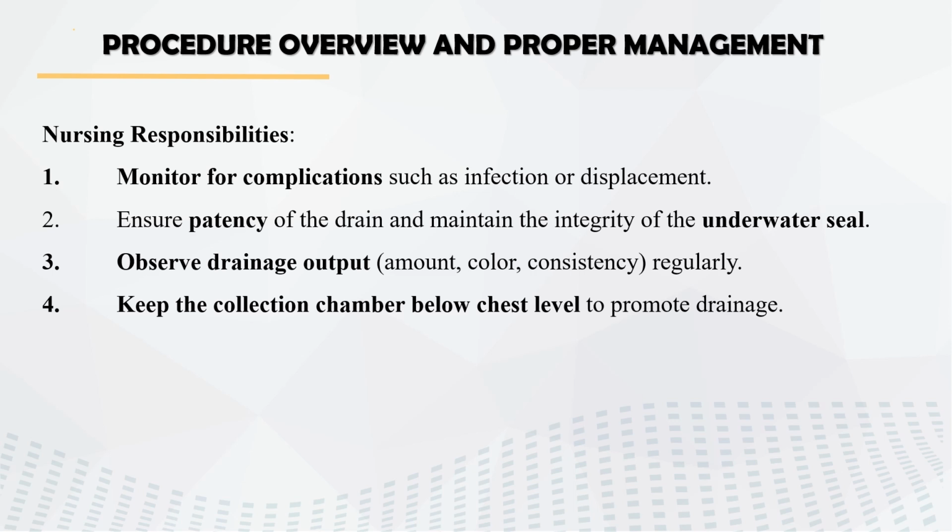This should be done regularly. Okay. So lastly, on nursing responsibility, we have to keep the collection chamber below the chest level to promote drainage. So it should be kept below the chest level and not above. Like I said before, it should not be above because the chest, the thoracic region, will have to take a flow back of the fluid if it is not below chest level.